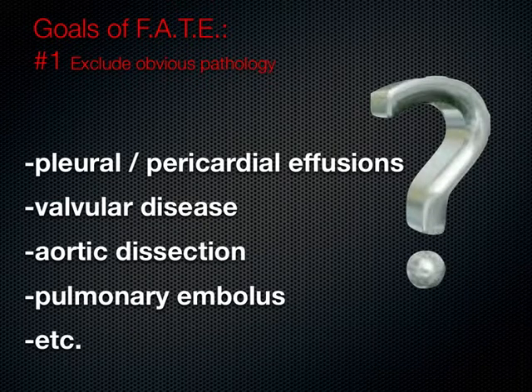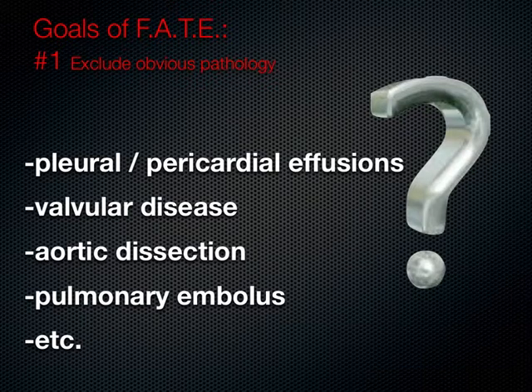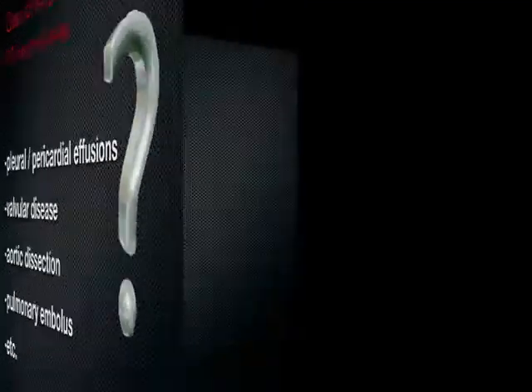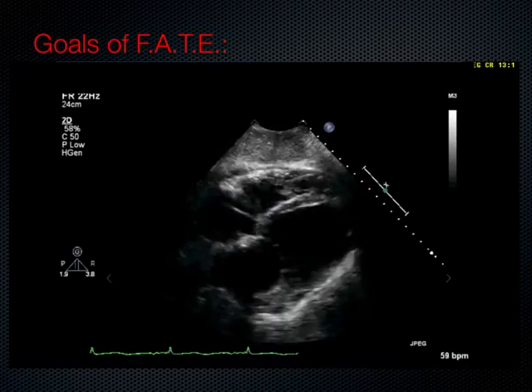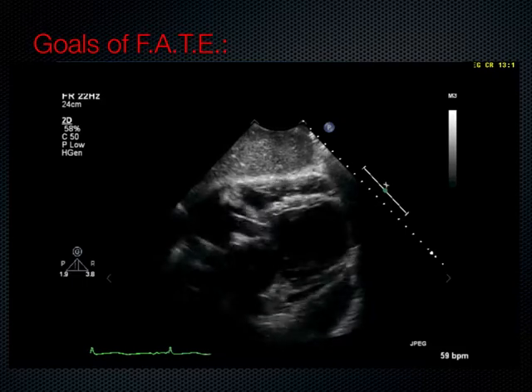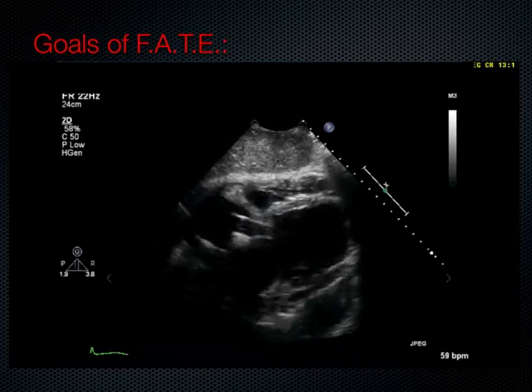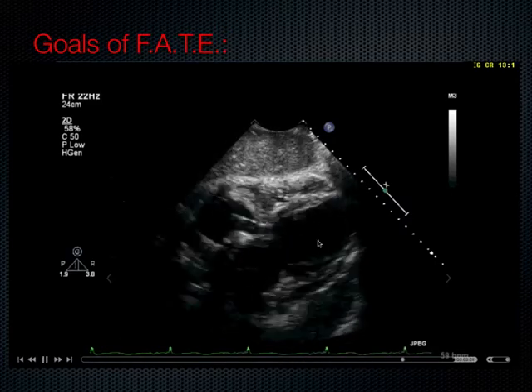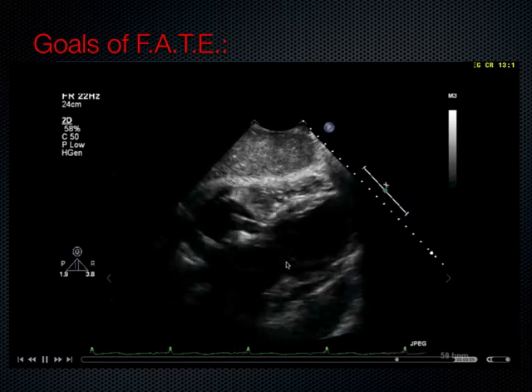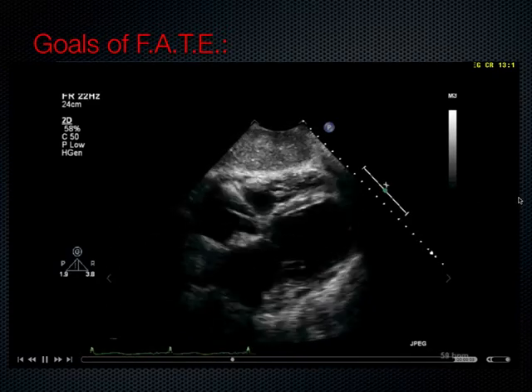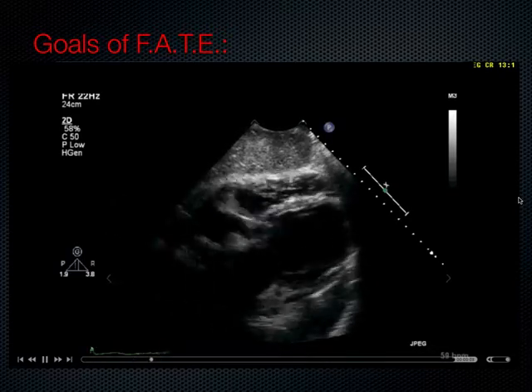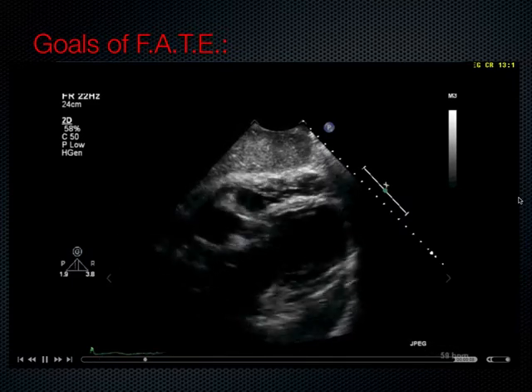Moving on to how to perform the FATE examination and what we may find: the number one goal is to exclude obvious pathology such as effusions, valvular disease, dissections, and markers of pulmonary embolus. For example, in a patient you know nothing about, you might immediately appreciate their cardiac history from a few findings — poor left ventricular contraction with minimal chamber size change, a poorly opening mitral valve, and a bright white hyperechoic linear structure which is a pacemaker wire. If a patient is found down and you see this, you know they have had a significant cardiac history.